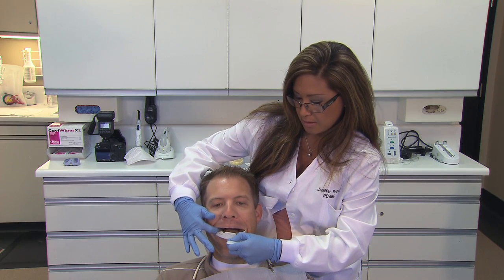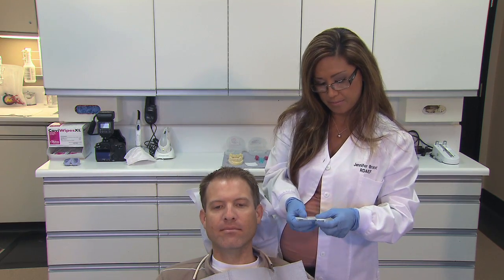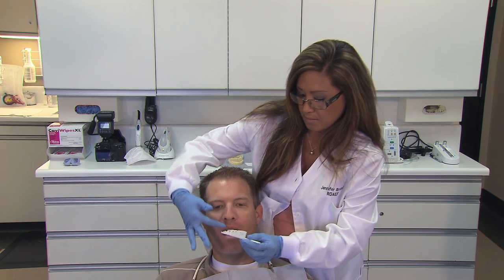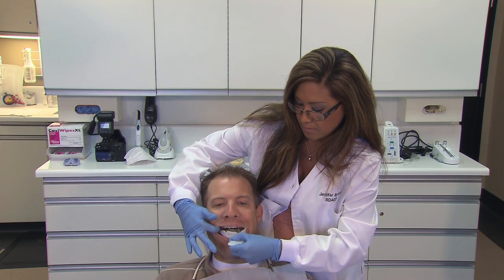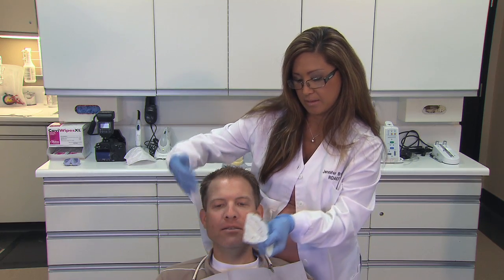So, for example, you can see my assistant was about to try to shove that large tray into his mouth. She's going to switch it to a size medium, click it into place, and try it in again, and verify that's the right size. So you're never trying in trays and not fitting and getting other ones and having to sterilize them because they were in the mouth.